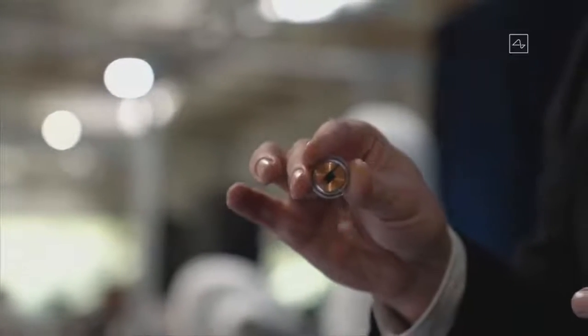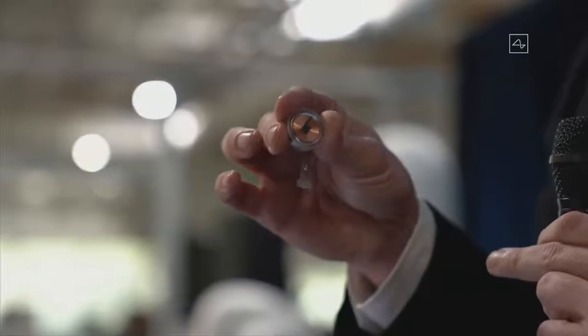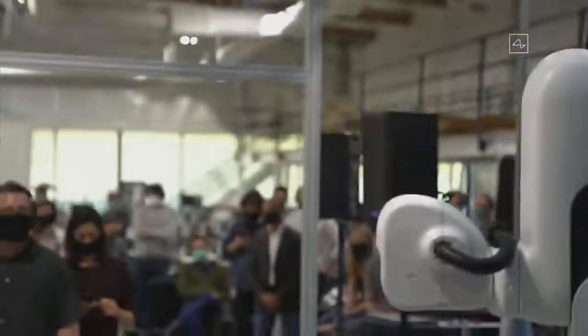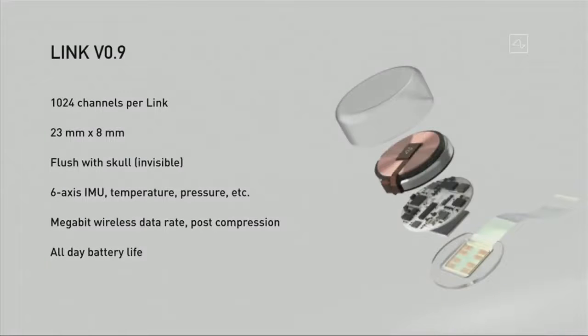This is our little device. That thing at the bottom is just to hold the threads in place, because they're just like little fine wires. To simplify this, it's more complicated than this, but in a lot of ways it's kind of like a Fitbit in your skull with tiny wires. Our current prototype, version 0.9, has about 1,000 channels, so that's about 100 times better than the next best consumer device that's available. And it's 23 millimeters by 8 millimeters.